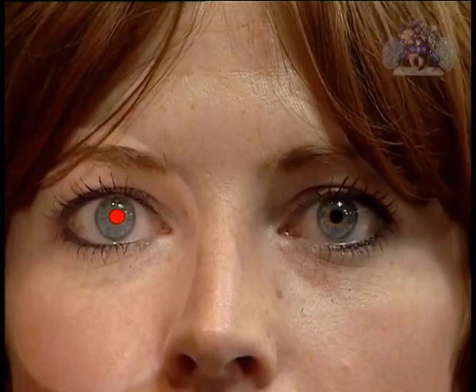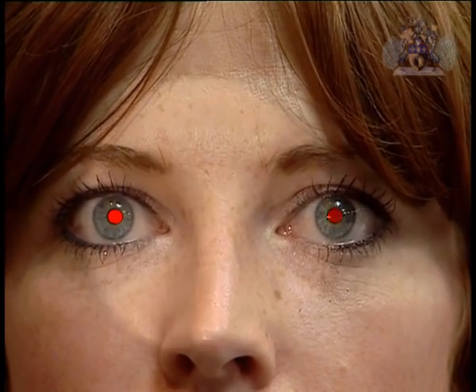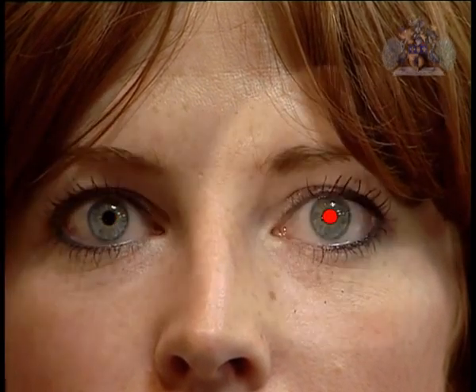Check the red reflex. Stand in front of the patient. From about arm's length, look through the ophthalmoscope and shine the light into each pupil. Compare one red reflex to the other.